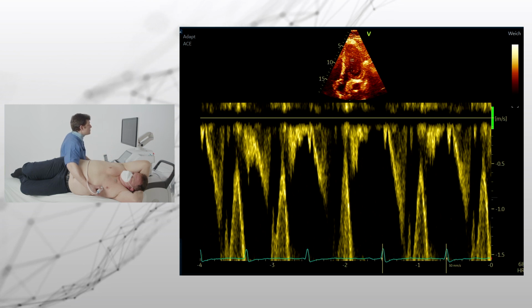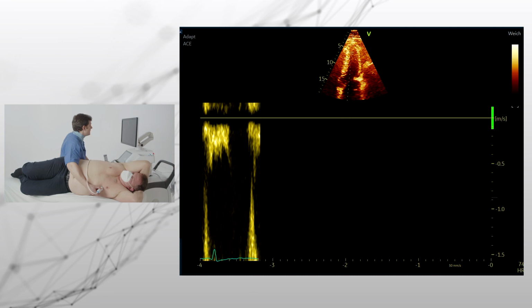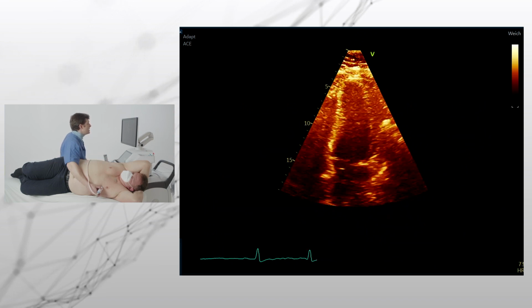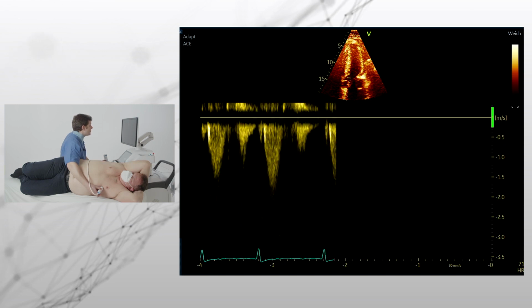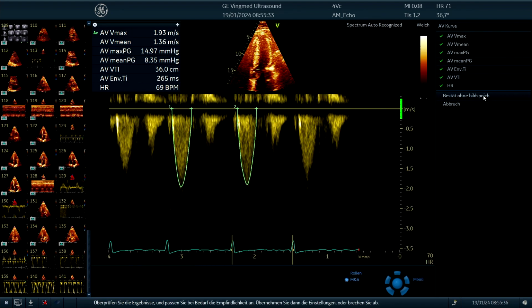So we have a patient with a thickened myocardium and several gradients we have to interpret. The mid-ventricular, intraventricular gradients, there can be patients who are really symptomatic. But overall, in this case, we mainly have an LVOT gradient, and there we simply can take a quick look.